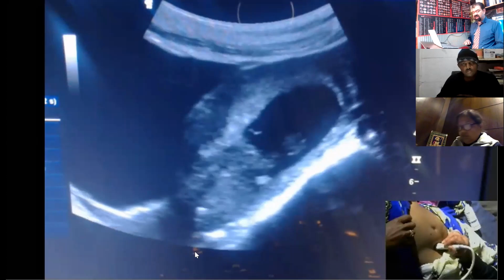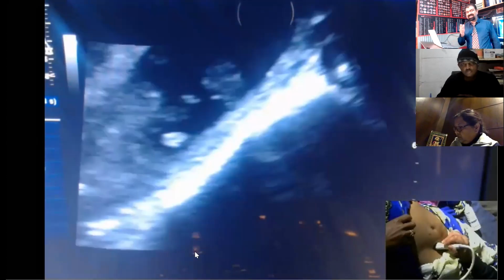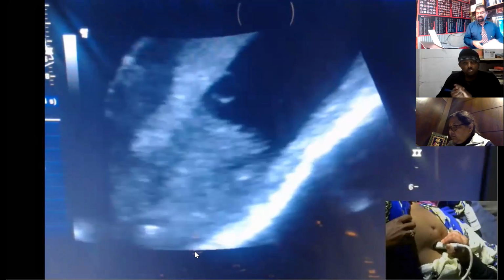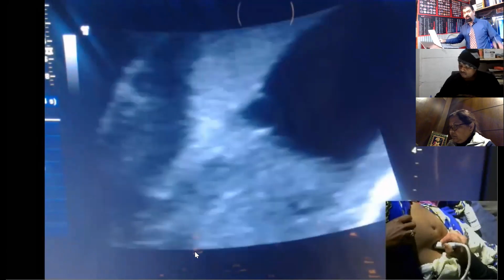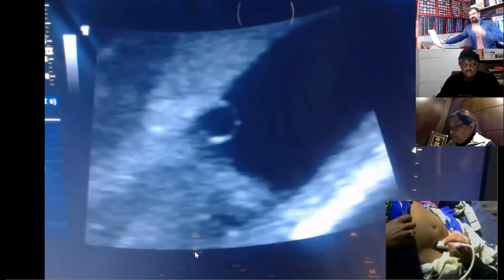And how much the fetal heart should be, you have to again correlate it with the CRL to say whether I am dealing with a normal or abnormal fetal heart, and how much is normal for which CRL. I am giving you a rough idea because this is already taken again in your course.